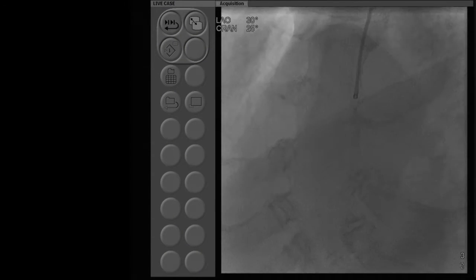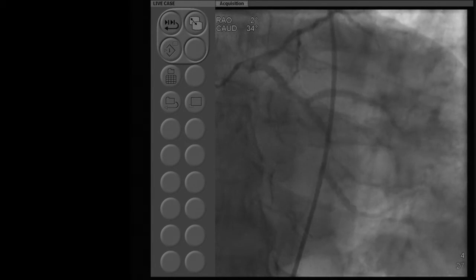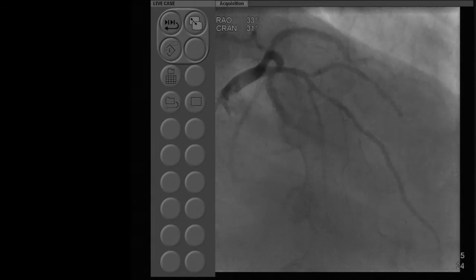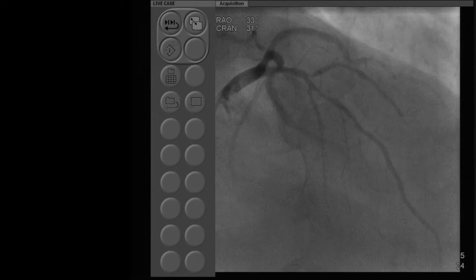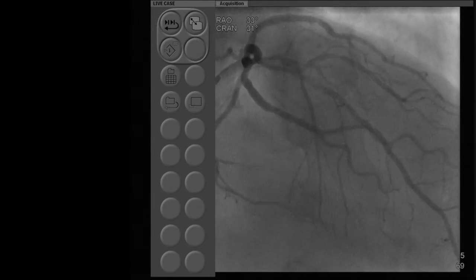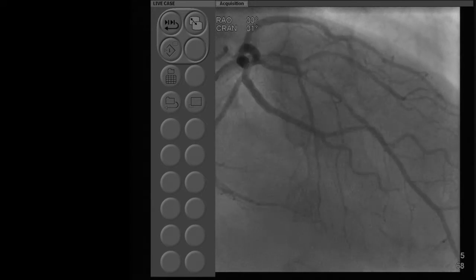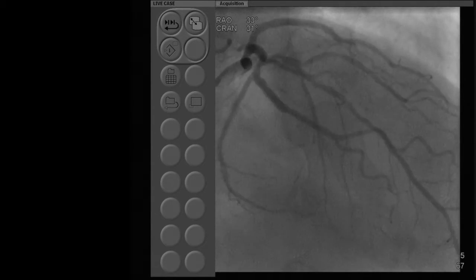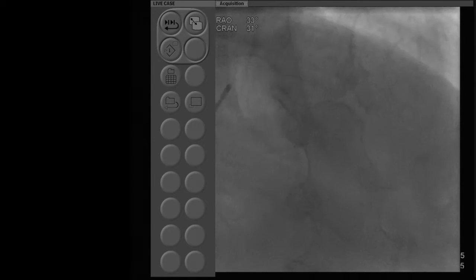This is the LV, which is normal. Right coronary is non-obstructive. Both the grafts are patent, and this is where we are with the LAD. I would say proximal is about 30 to 50 percent. Then you have what we call a bifurcation just at the level of the diagonal — you would say less than 30 — but after that there is moderate diffuse disease all the way to the distal LAD. The diagonal at the ostium may be about 30 percent or so. Angiographically you would call it a borderline to intermediate lesion — 50 to 70 percent.